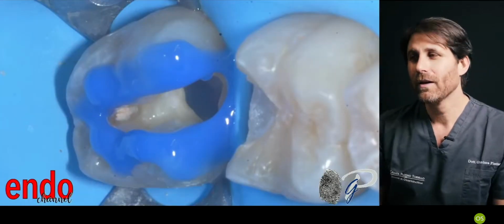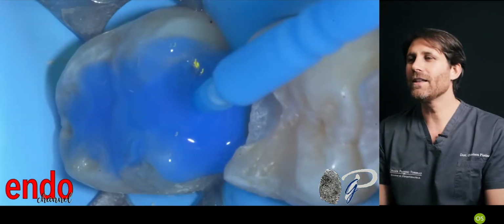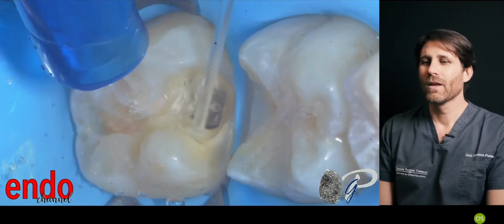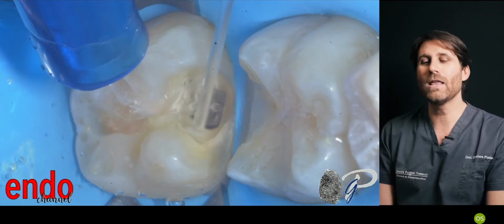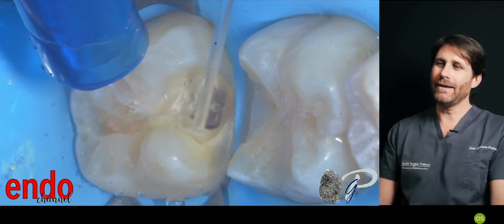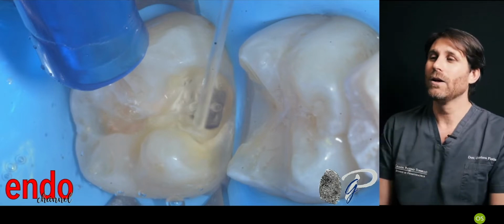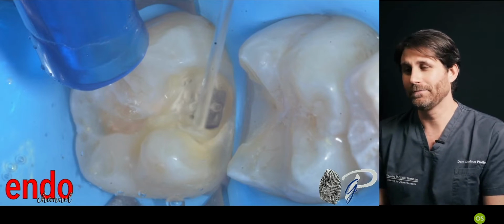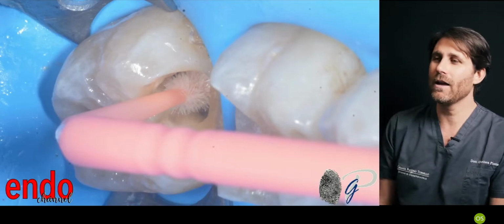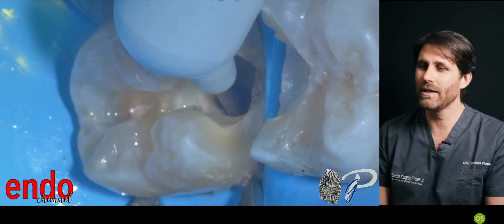Restoration phases: etching, selective etching of the enamel, etching on dentin, agitating the etching to increase its efficacy, cleaning with water very effectively. We have to take care to remove all the etching very well from inside the pulp chamber, and then we perform all the adhesive procedures with all the devices and the appropriate materials that we have.